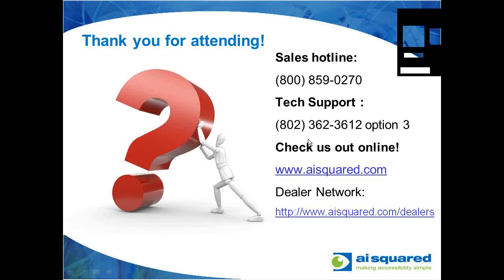We did have someone else ask about the laptop built-in webcam. A lot of laptops, even the one that I have right here, have a webcam built in that's really meant for things like Skype or other video chatting programs. And that's definitely not something that you can use for the ZoomText camera.